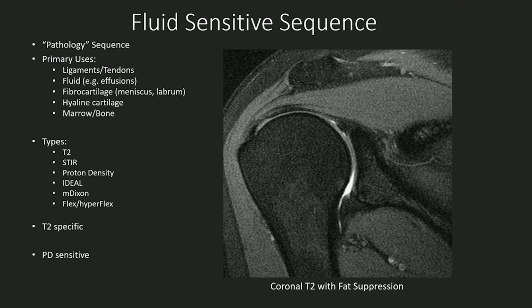Again, not to bog people down, but really when you look at MRI, the key is to think, what sequence am I looking at, and what is bright on this sequence? What is dark on this sequence? And then you can understand what pathology looks like and what normal looks like. I think that's the thing to focus on, with those categories really being the most common: fluid, fat, blood, and what normal structures look like, tendons being dark.